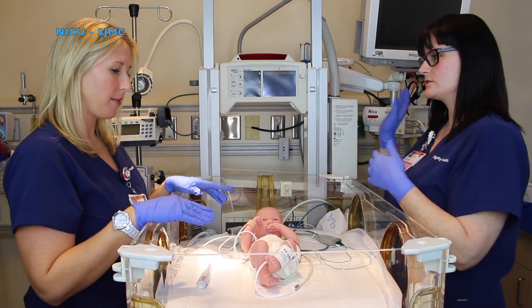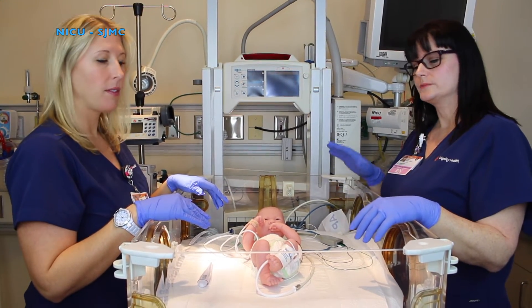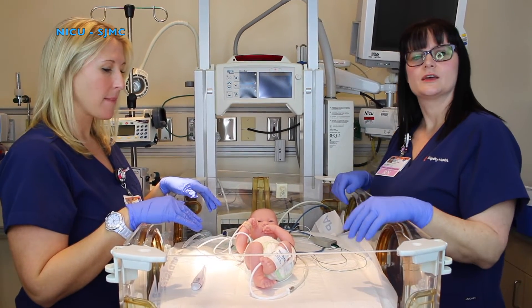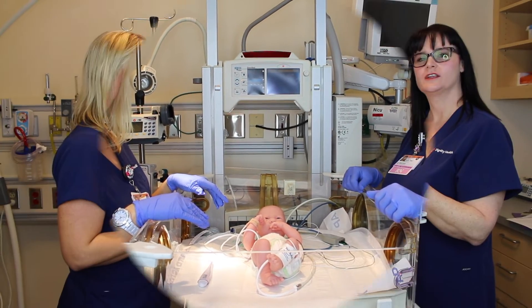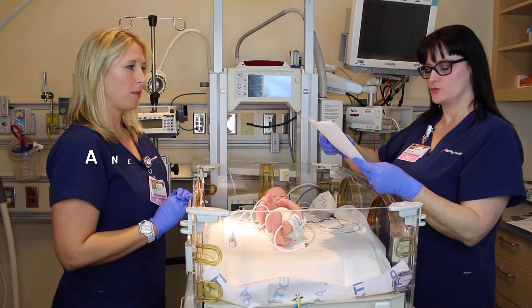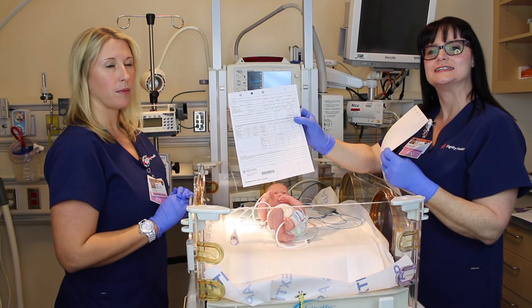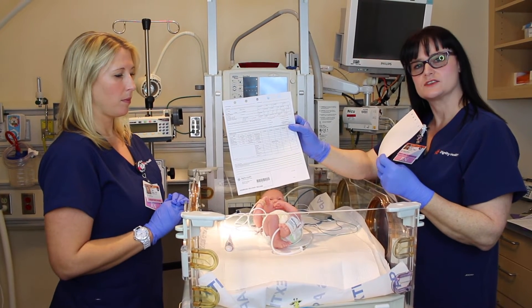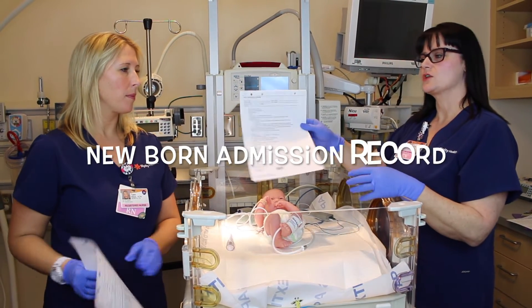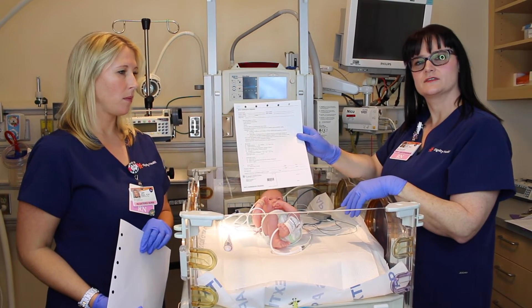Now that you have your baby hooked to the monitor and your weight and measurements done, you can record your first set of vital signs. Then you're going to obtain a blood sugar on your baby to get a baseline, and then you'll be ready to call the physician to update them on the baby's condition. When you're ready to call the physician, you'll need two pieces of paper: the newborn delivery record, which contains the mother's history and baby's delivery information, and a set of newborn admission orders so you can record the physician's orders as they're given to you over the phone.